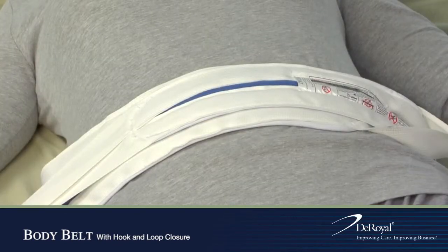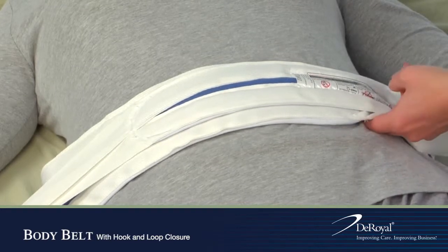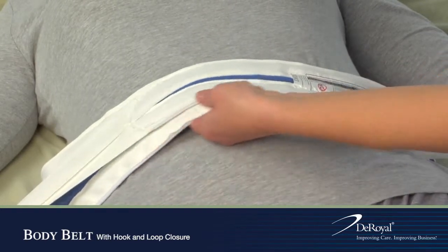Do not over-tighten. Two fingers should fit between the device and the patient to ensure circulation is not compromised.